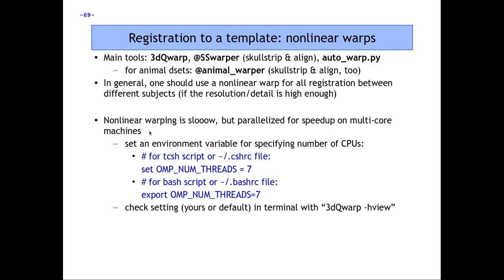The rumors are true — nonlinear warping is slow, but there are things that help. It's not impossibly slow, and the underlying program 3D-Q-WARP was written inherently parallelized for speed-up on multi-core machines. If you have more than one CPU or thread, you can speed up 3D-Q-WARP quite a bit. There's an environment variable called OMP_NUM_THREADS. The parallelization was done using OpenMP, so if you have eight cores, you could designate seven for nonlinear warping. This is the syntax in T-shell and in Bash.